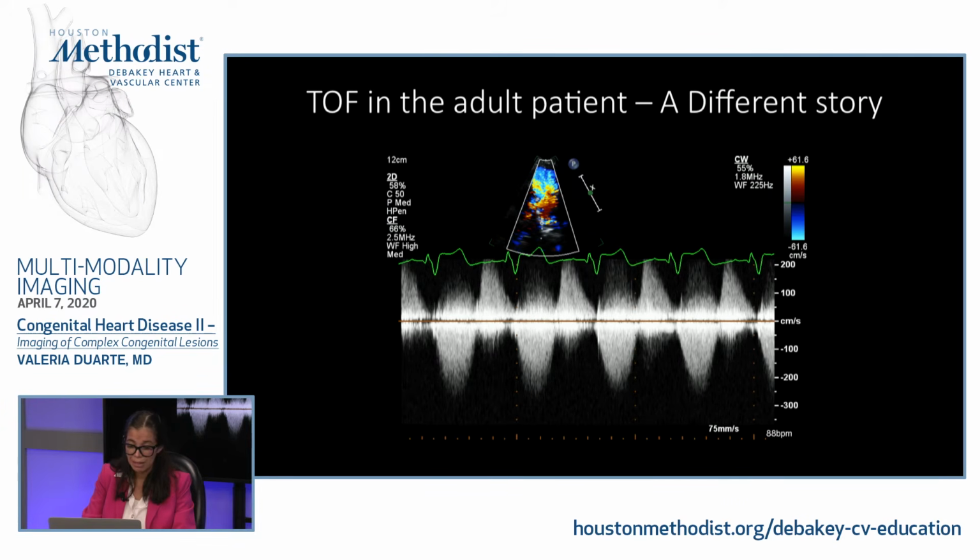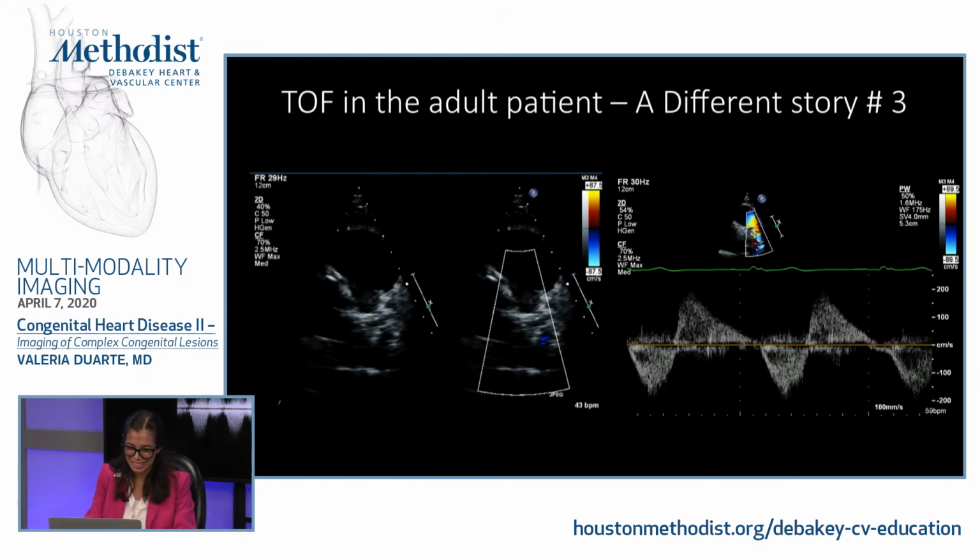Okay, and one tip that I ask all the sonographers is to move the baseline down so I can see the full envelope. Sometimes I only get the forward flow and I'm missing this, and you can see how this is very important for me in these patients.